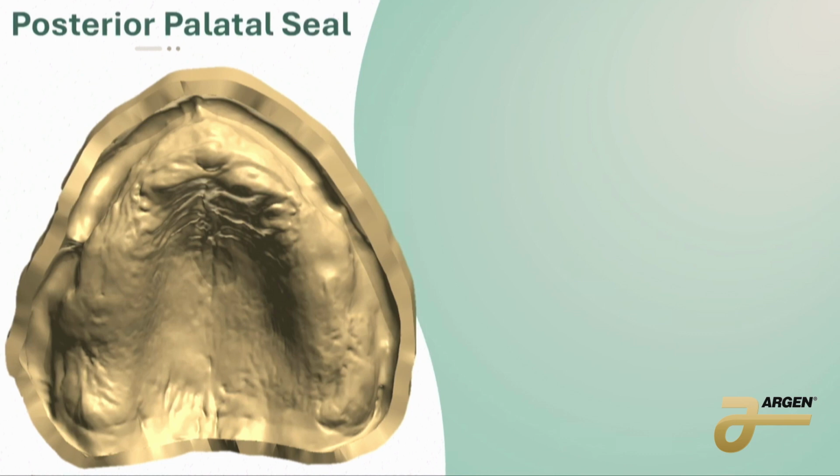If we were to look at different types of the vault of how vaulted your palate is, it makes a big difference. So there's actually 3 classes to how vaulted the palate is. So class 1, if you can imagine, has kind of like the ridges here, kind of flat.